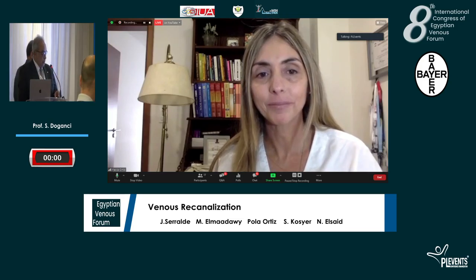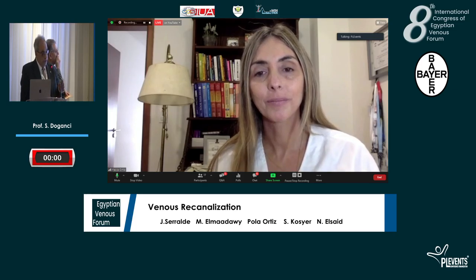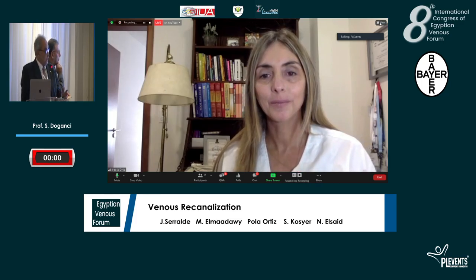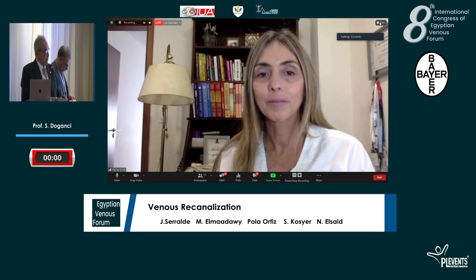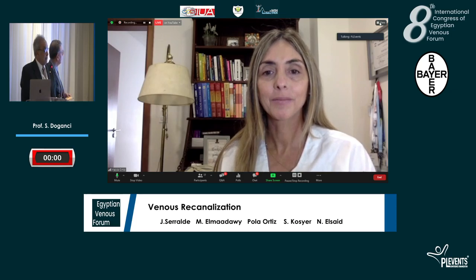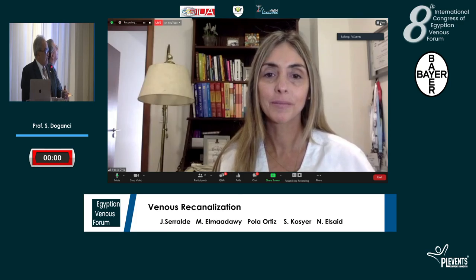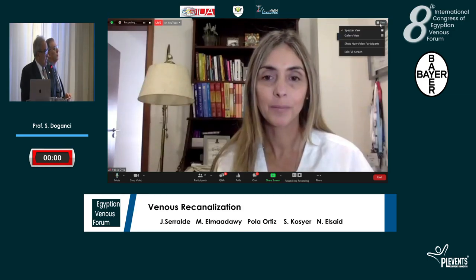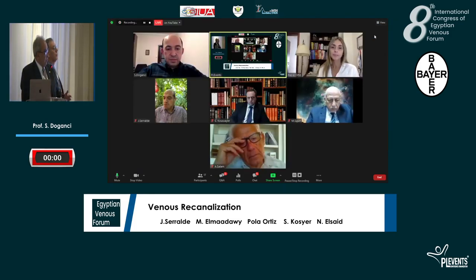Thank you. I enjoyed your lecture very much. Of course, talking after Littenberg will be very difficult, as you said, but I have some questions. As we know, venoplasty is totally different from angioplasty or dilatation of the arteries. For example, as you mentioned, you can keep a segment without stenting, an escape segment, and you are not afraid of troubles in the venous system. Angioplasty of the common iliac arteries is mandatory to be followed by stenting. May I ask you, what are the rules for stenting of iliac veins, when we should stent and when we may not stent iliac veins?